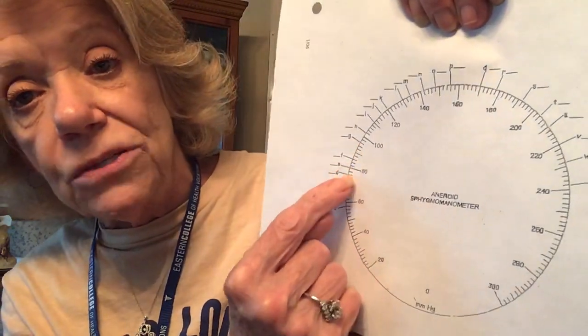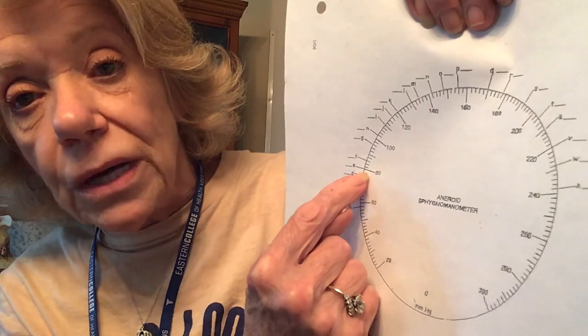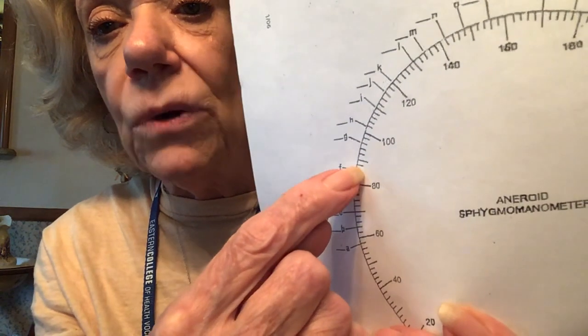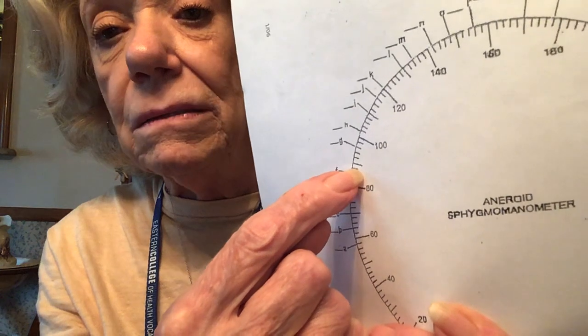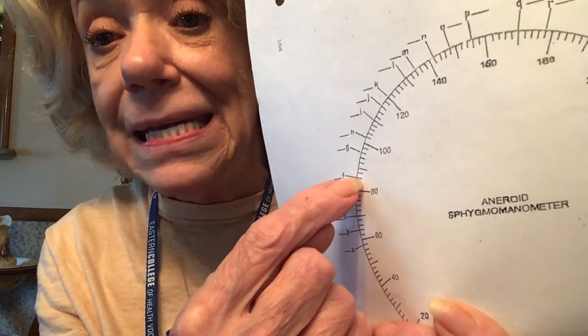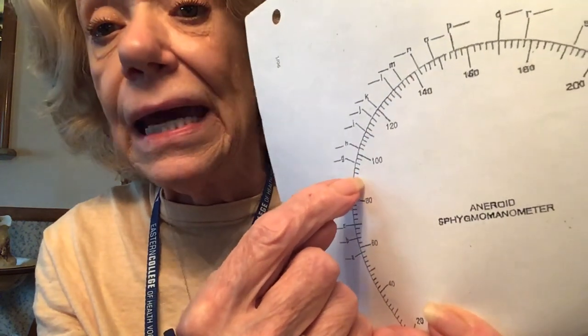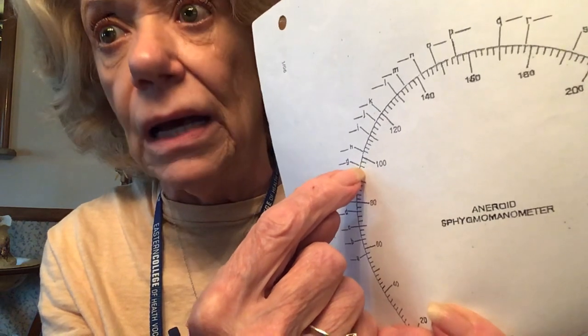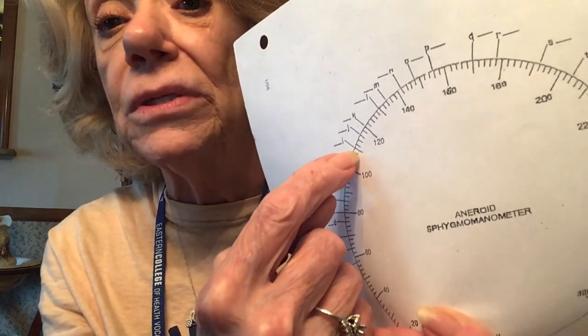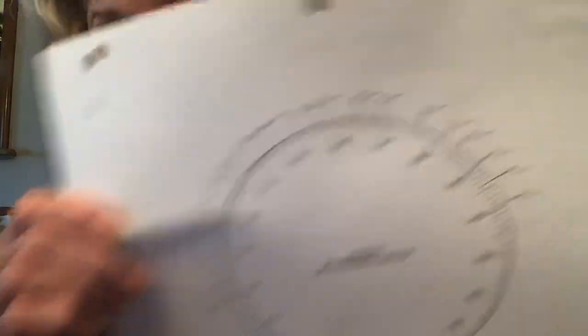On the blood pressure gauge, each individual line represents two units. So reading goes: 80, 82, 84, 86, 88, 90, 92, 94, 96, 98, 100, 102, 104, 106, 108, and so forth. Every little line is the whole number two.